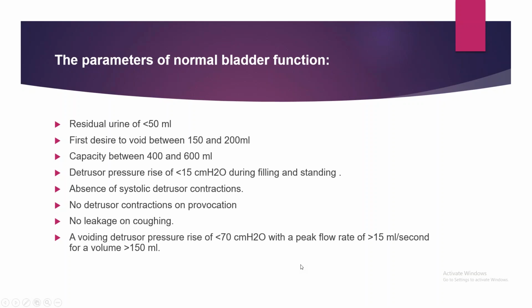Yes, ma'am. These values are very important. Excuse me, ma'am. Is this residual volume, post-void residual volume, less than 50 or 100? What is the normal value? That's why I'm telling now.